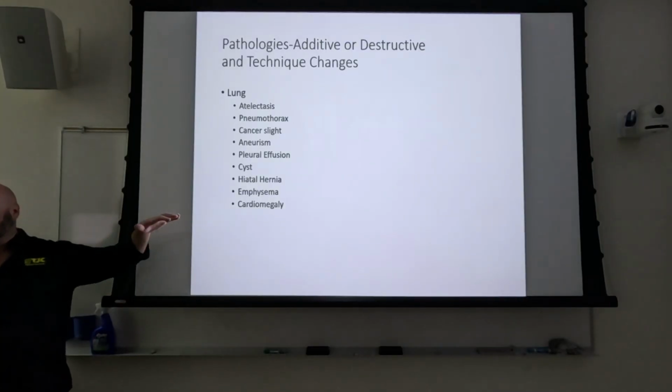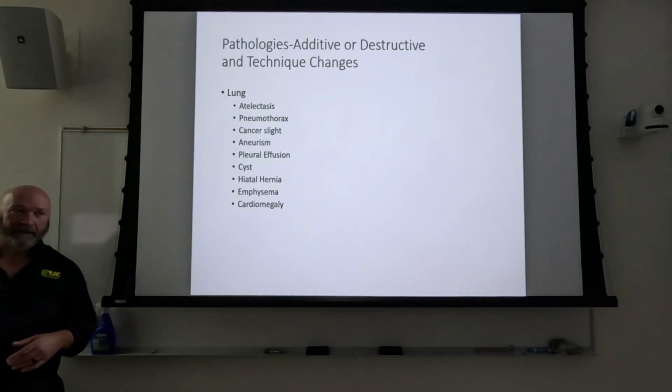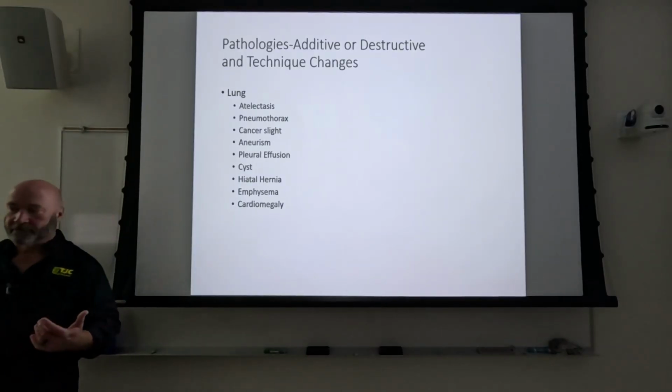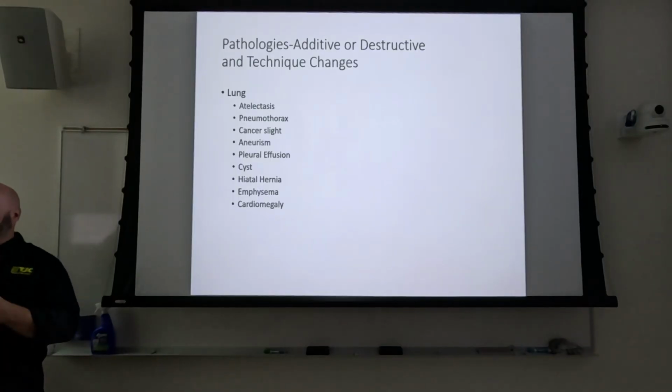We took a decubitus chest on a patient with massive pleural effusion, and we could see absence of lung, but we couldn't see where the pleural effusion ended. And then we went back and we shot it with a grid. It's one of the most stark examples of what a grid can do for you that I ever saw personally. It cleaned up enough scatter radiation you could see exactly how full that lung was.